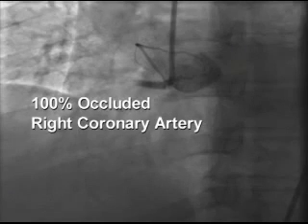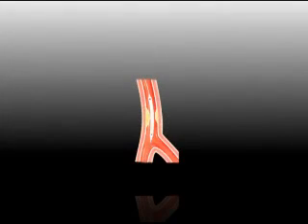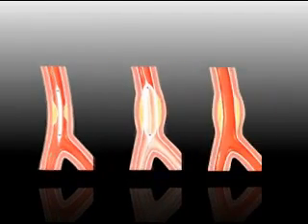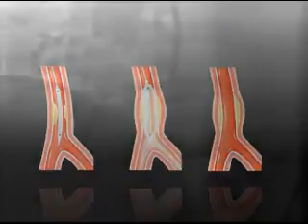While observing the artery on an X-ray, a 0.014 inch diameter steerable guide wire is threaded through the guide catheter and advanced past the occluded segment. A balloon catheter is inserted over the wire and positioned into the blockage. The balloon is expanded, compressing the plaque against the lining of the artery, restoring blood flow to the downstream artery and heart muscle. After balloon inflation, the artery may be stented.